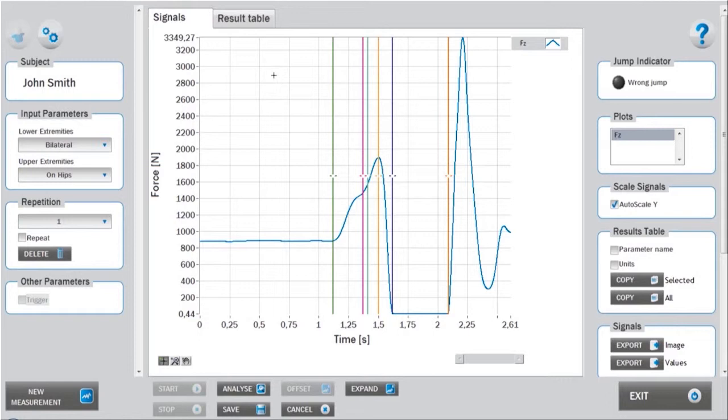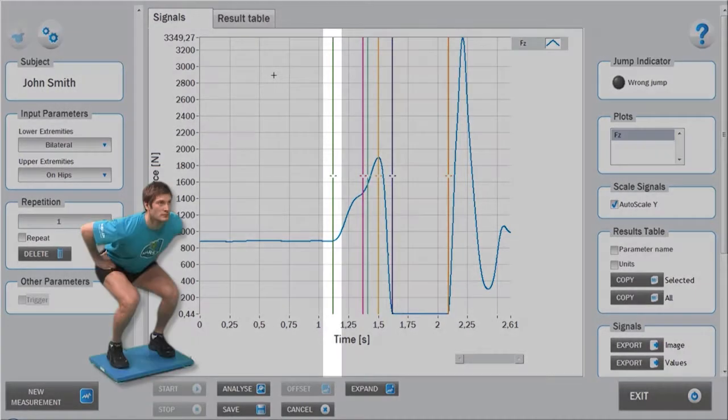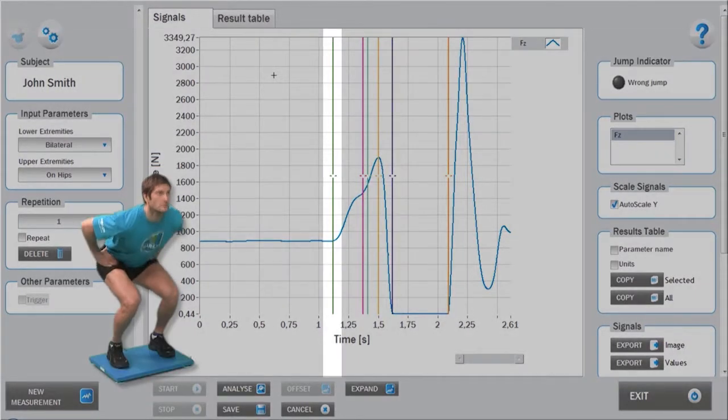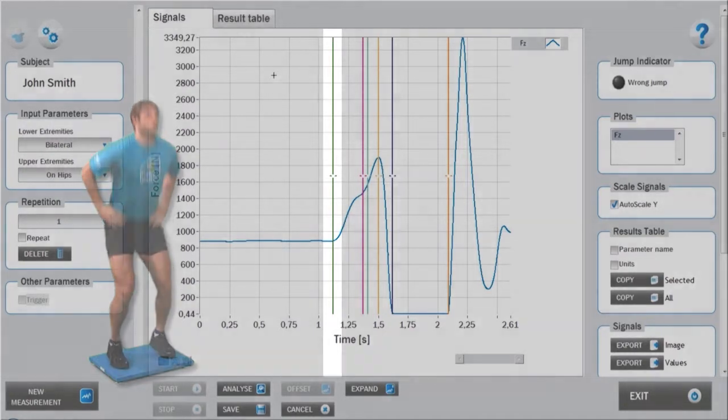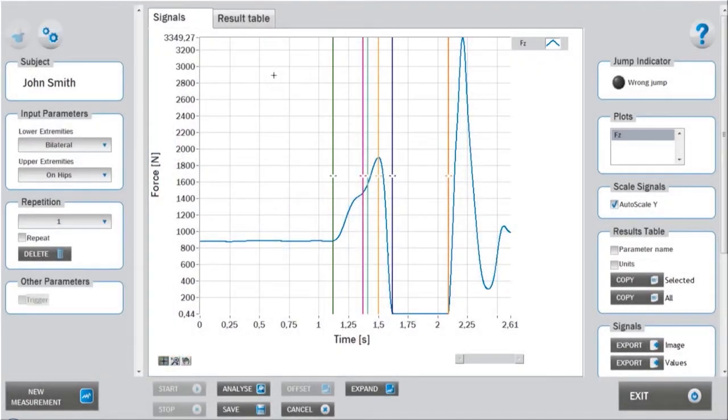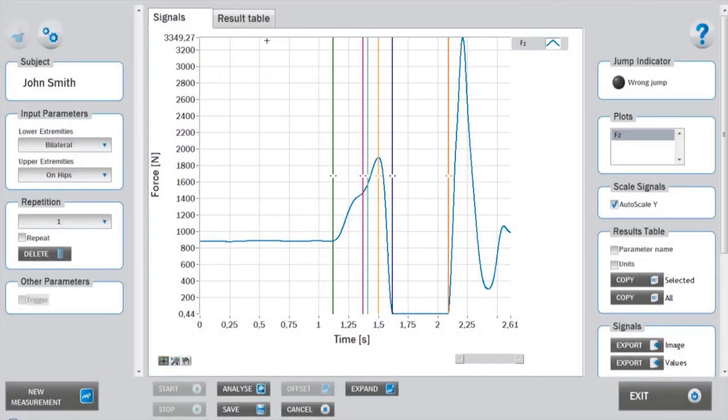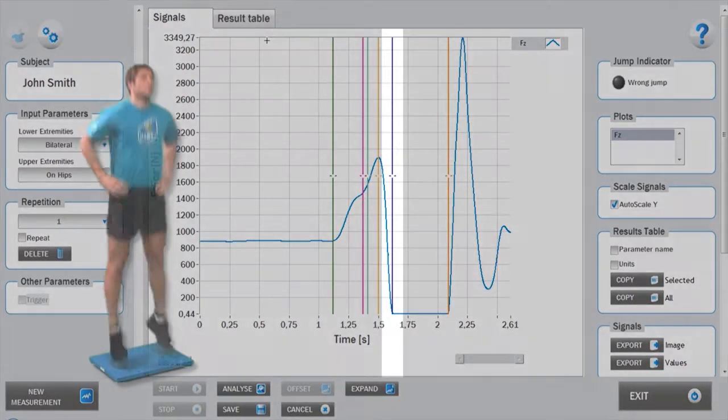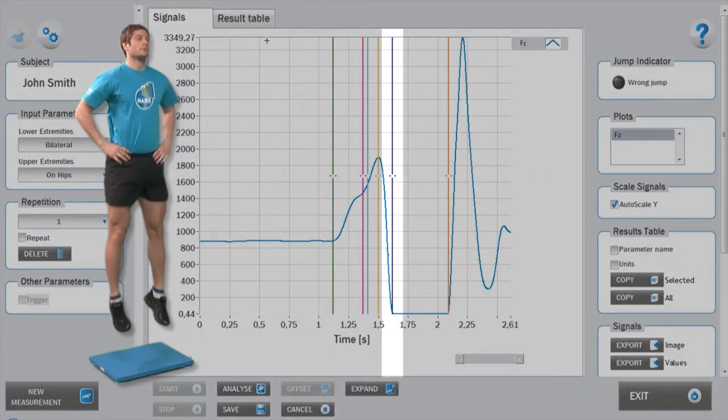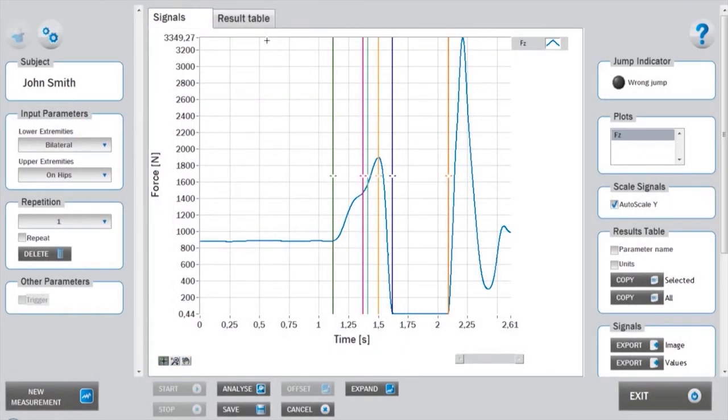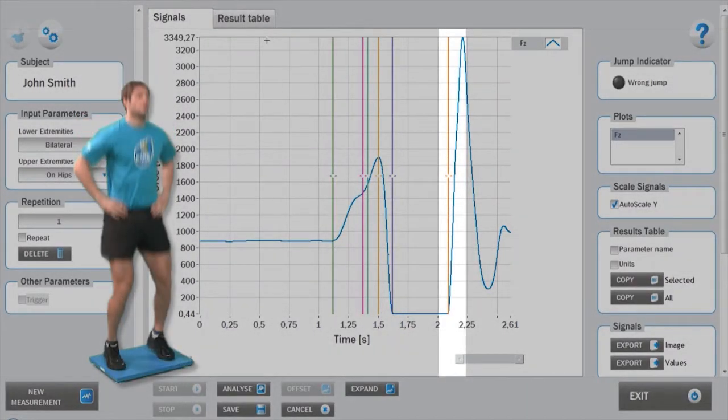The initiation of the push-off action, marked by start cursor, is identified by a steep increase in the ground reaction force profile. Takeoff and landing can be easily identified by the moment when the ground reaction force falls to zero and starts to increase again.